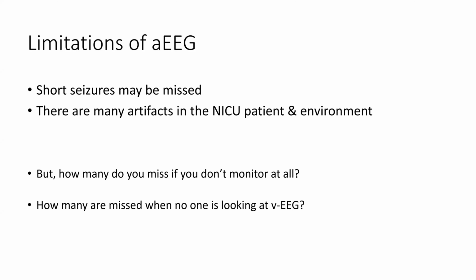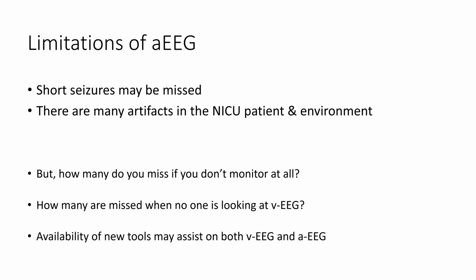And even if we use video EEG, you should still be using aEEG, because there are many hours in every day where video EEG is commonly not looked at all by anyone. And so we need to be using aEEG at the bedside and looking for these things right away.